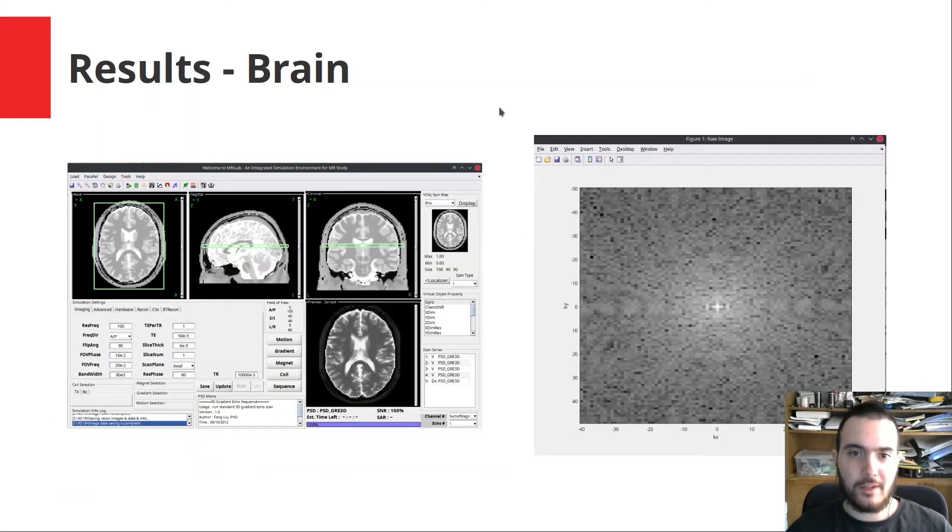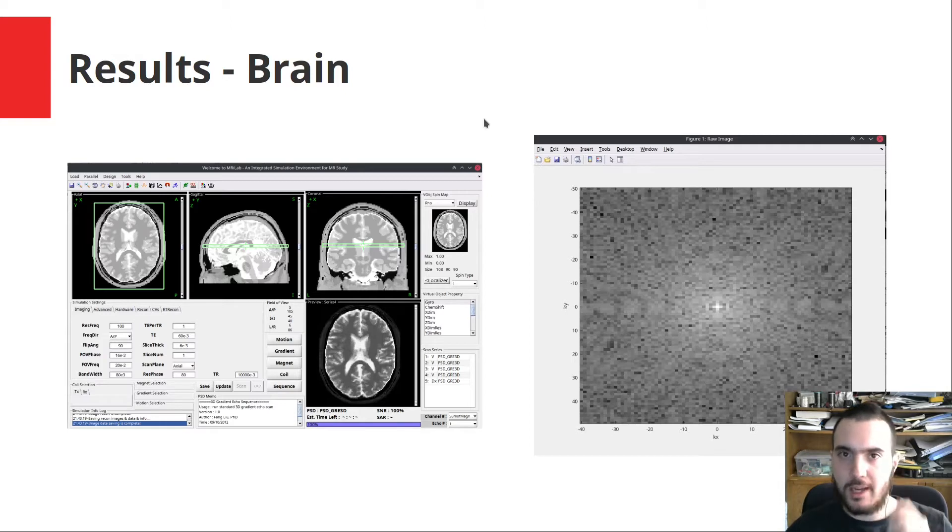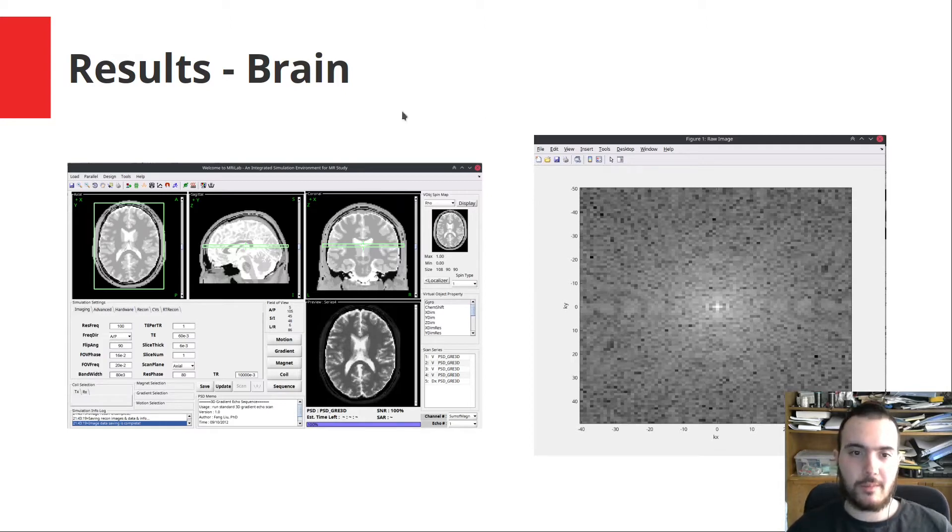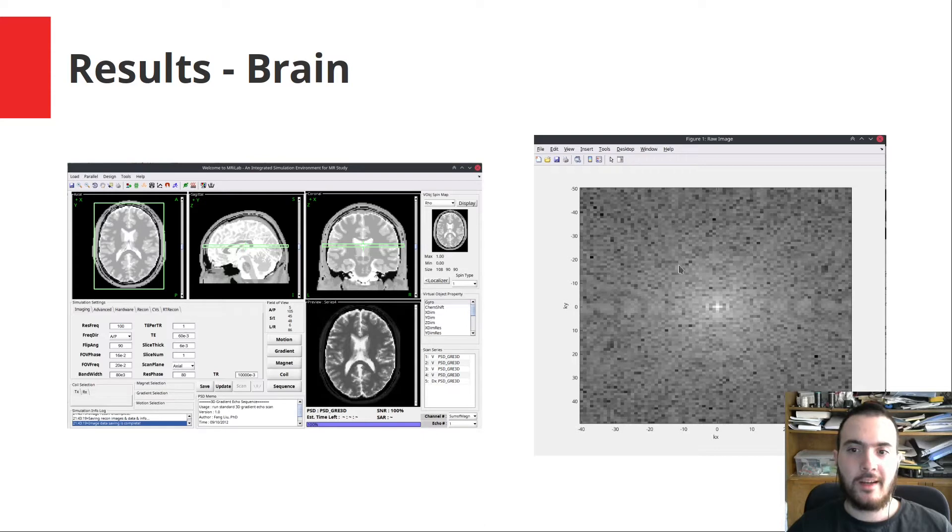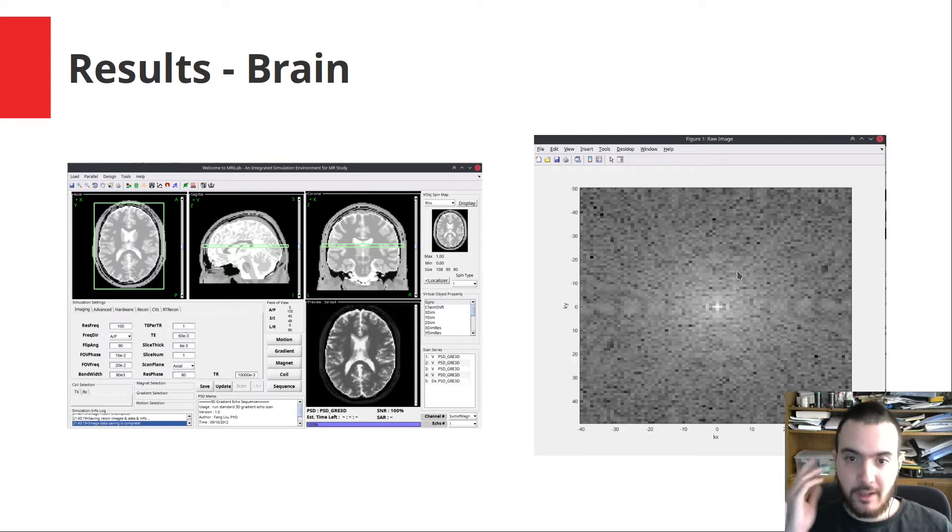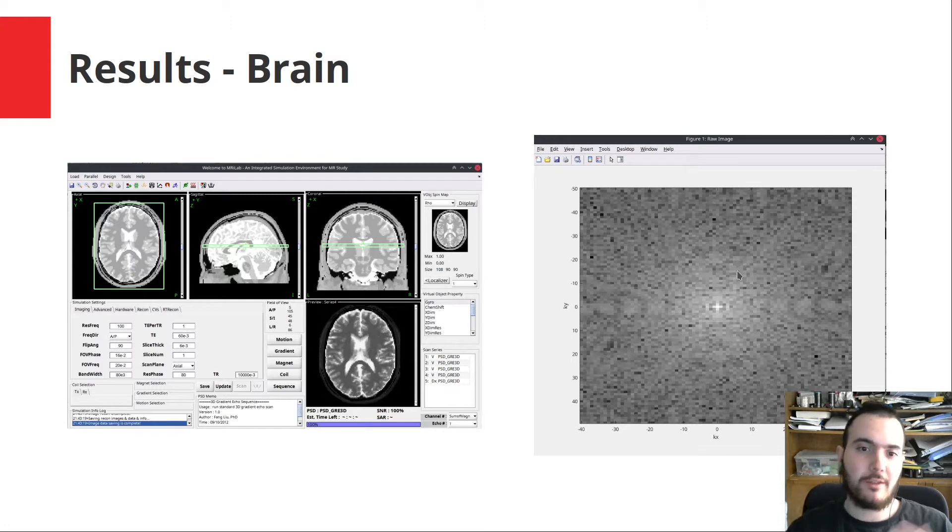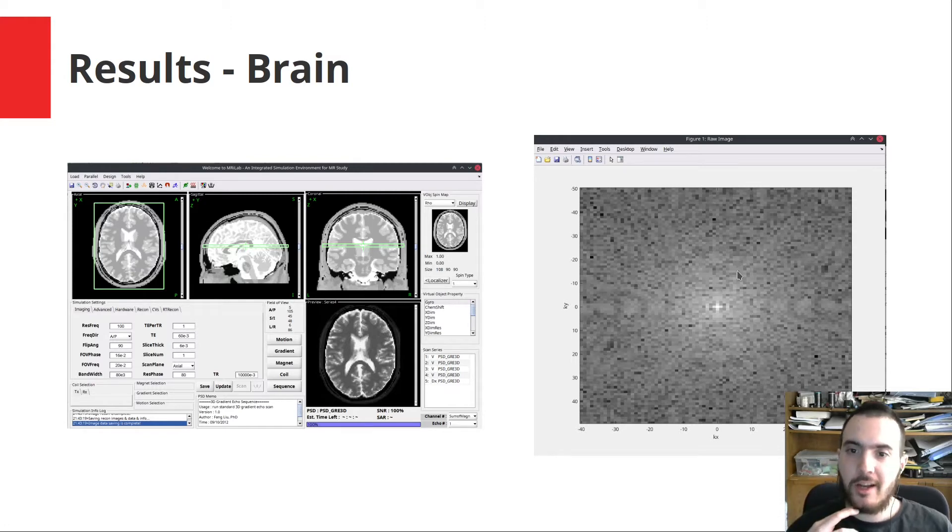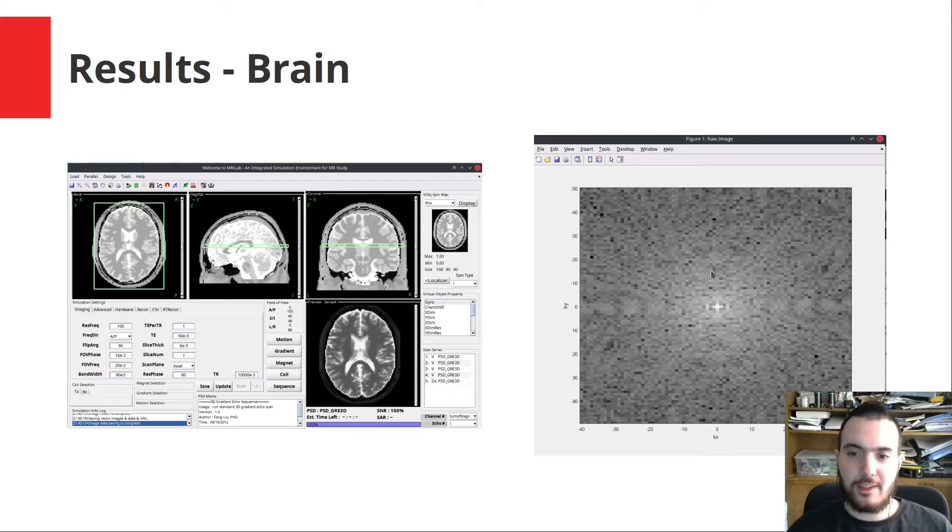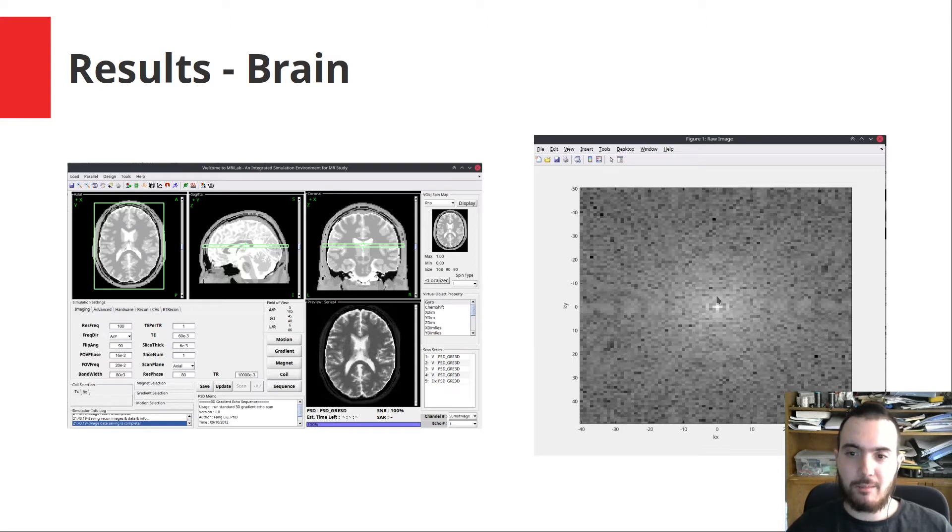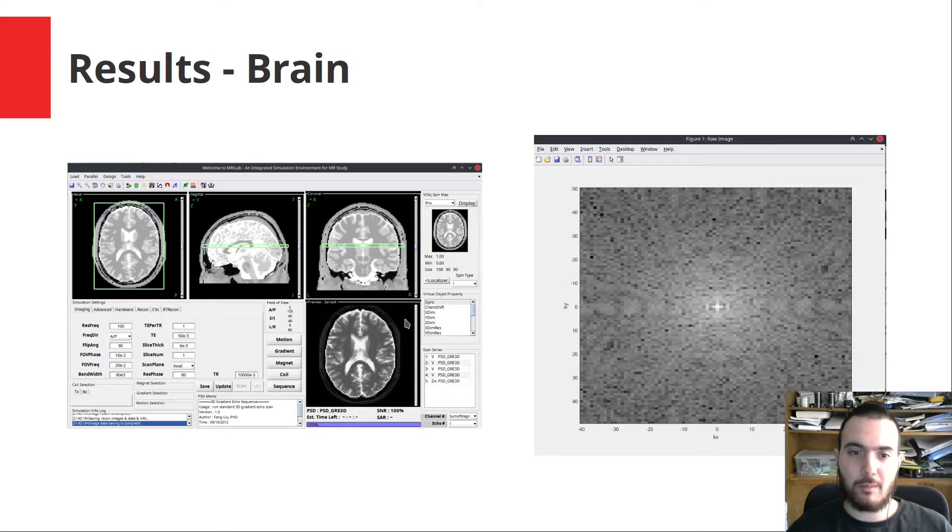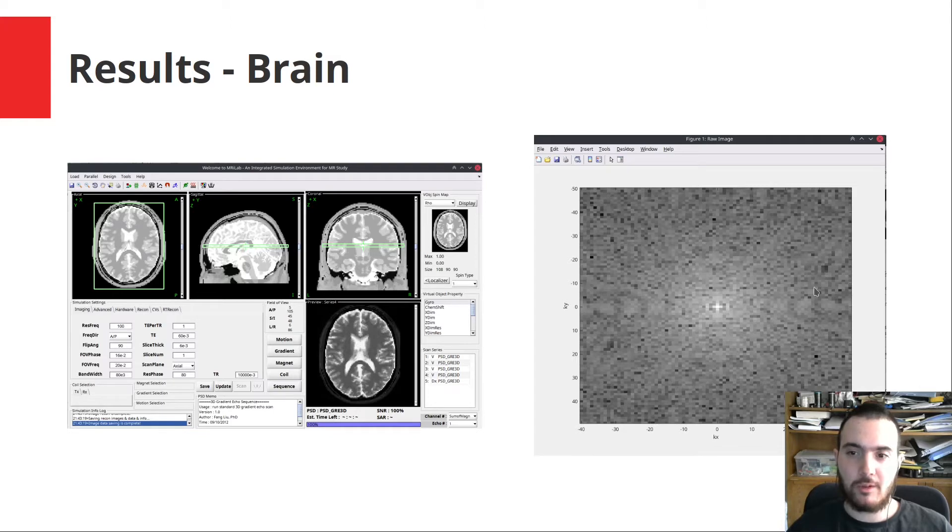Here are some results from the software. I will do a live demo later, but this is for some examples. As you can see, this is a brain example, and here we see the raw image of that. From the theory we know that there must be a Fourier transform correspondence between these two. While this is not really clear because it's a complex image, at least we can see that the image is the brightest in the middle as one would expect, because the DC components are the highest in magnitude.